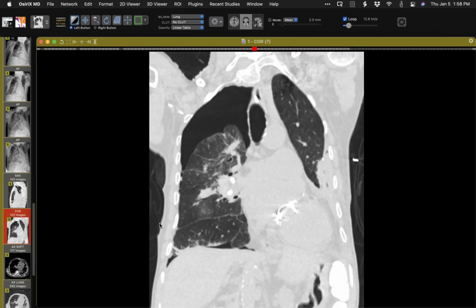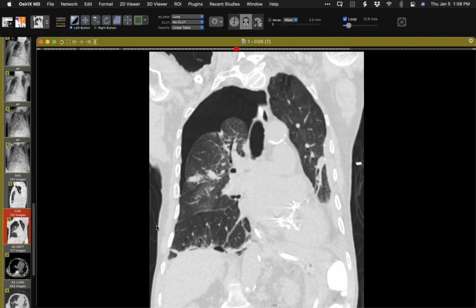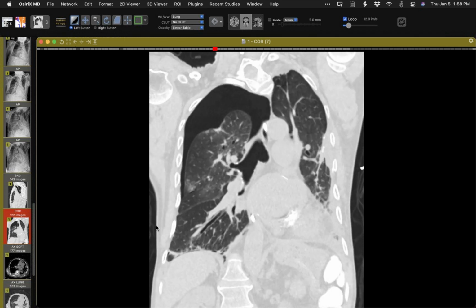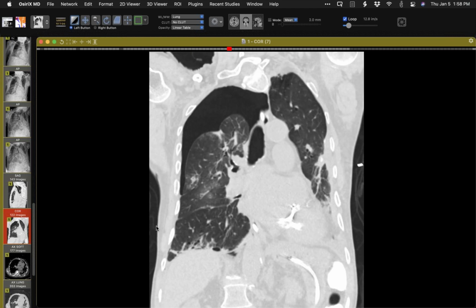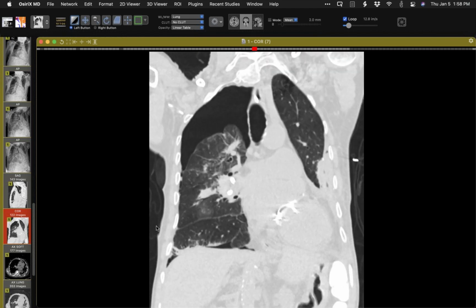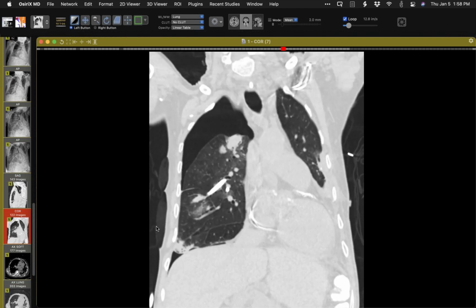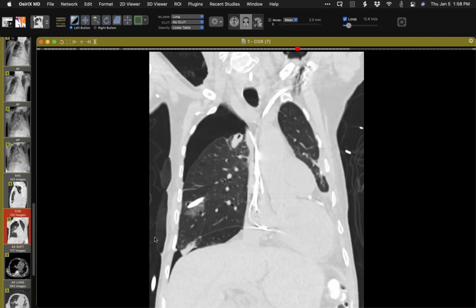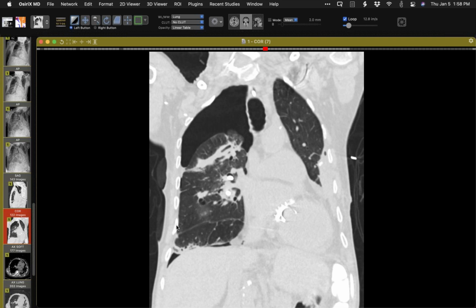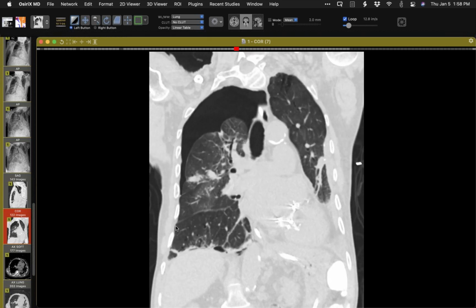When they place these pigtails, do they have a stiffening wire to straighten out the curve on the end, the curl? I don't know. I need to ask somebody, and I do have a colleague that puts these in. I'll ask him the method and the technique they use, and how they might end up going into lung, even though they're relatively small things, like this one did. They must have something like that that straightens it out, and then that turns it into a lethal weapon.